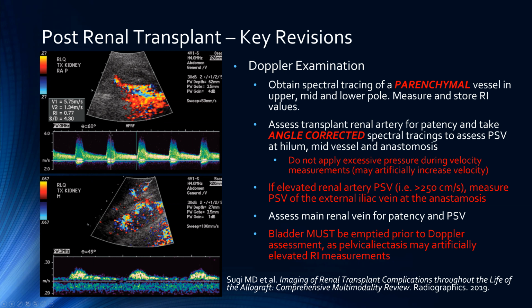Oh no, sorry, this one was a little bit elevated here. And then downstream of the stenosis, particularly if the stenosis is quite tight, you'll end up with a decreased velocity with a tardus parvus waveform, so a slower upstroke and downstroke of the systolic velocity.